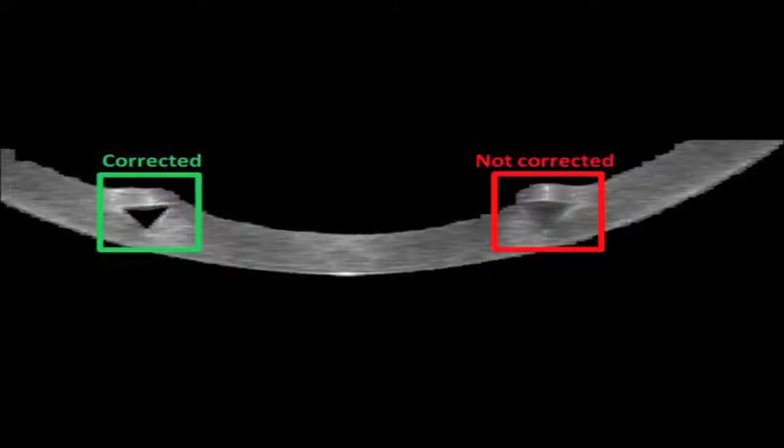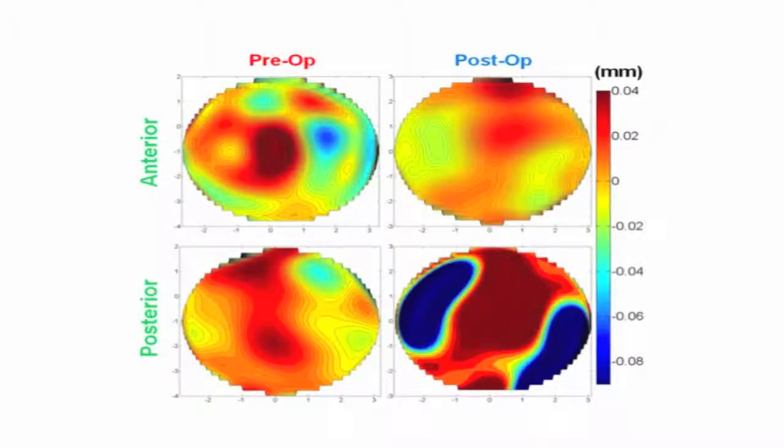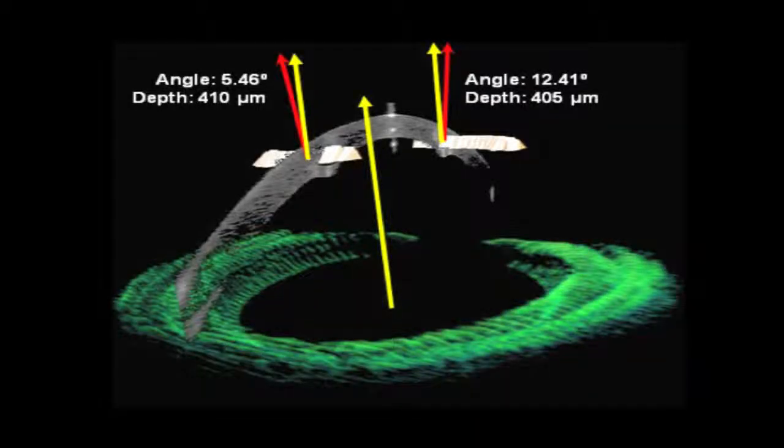The developed tools have allowed us to measure quantitatively the geometry and topography of the anterior and posterior cornea before and after implantation of intrastromal ring segments. The segments produce a flattening of the anterior cornea and some symmetrization and redistribution of corneal thickness within the optical zone. The correction of the optical distortion allows us to quantify the backward protrusion of the posterior cornea behind the rings and to monitor the location and rotation of the segments.